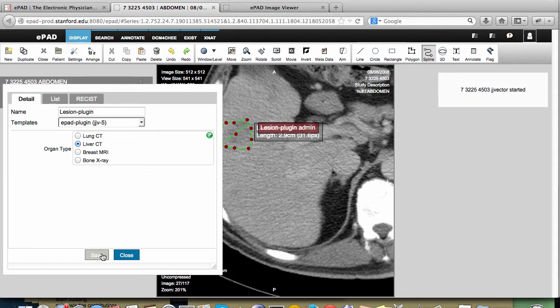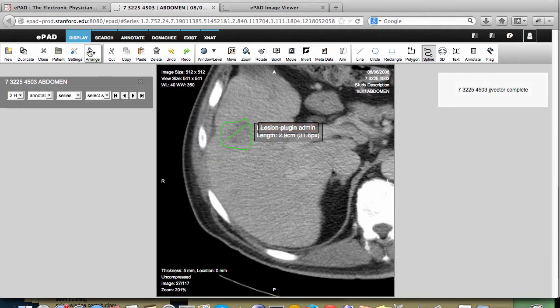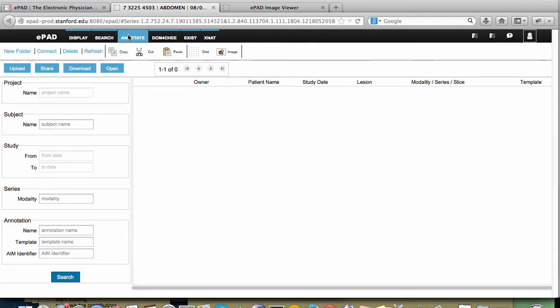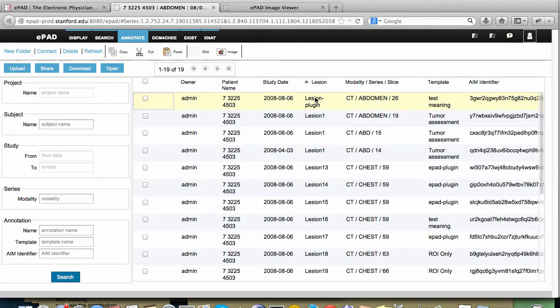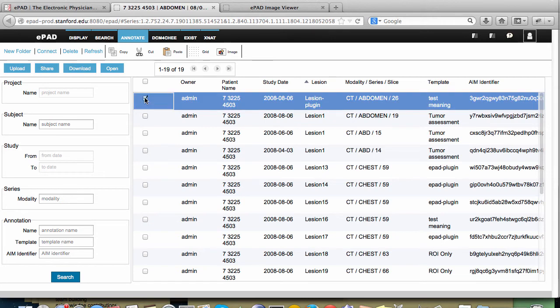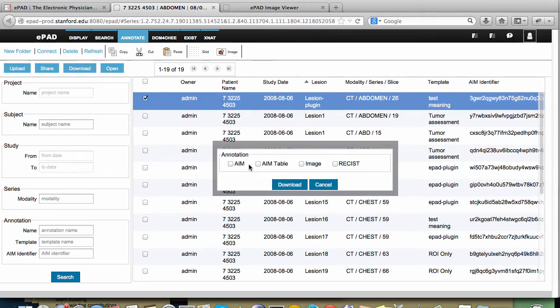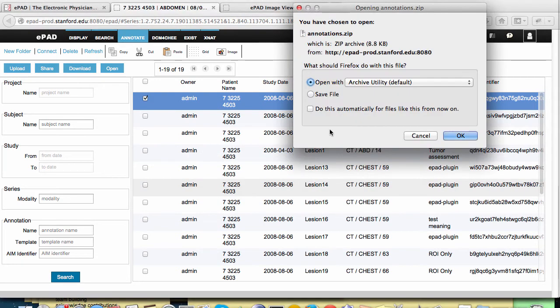Plug-ins can sometimes take a while to run, so EPAD tells you when it starts and lets you know when it's done. Now it's done. I can look at the results of this plug-in by either downloading the annotation — lesion plug-in — as the actual AIM or as a spreadsheet. I'm going to download it as a spreadsheet and save the file.